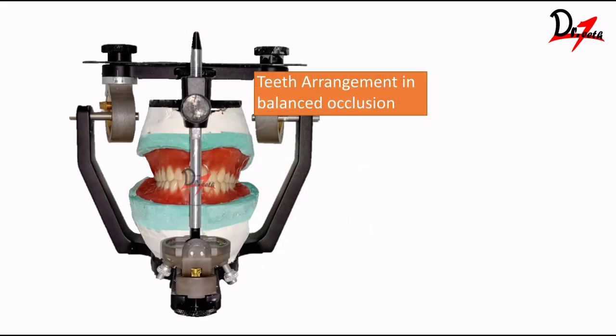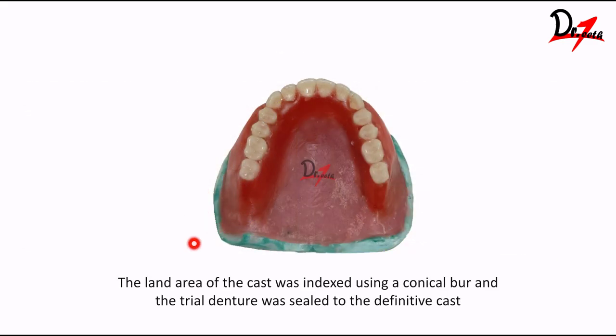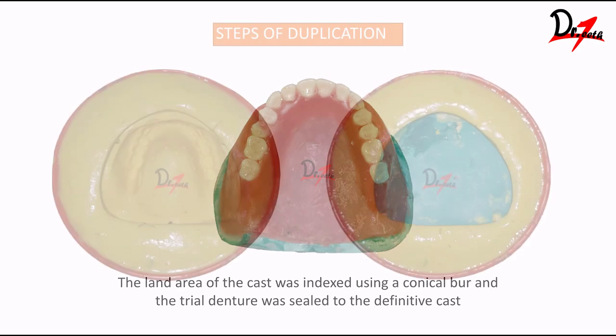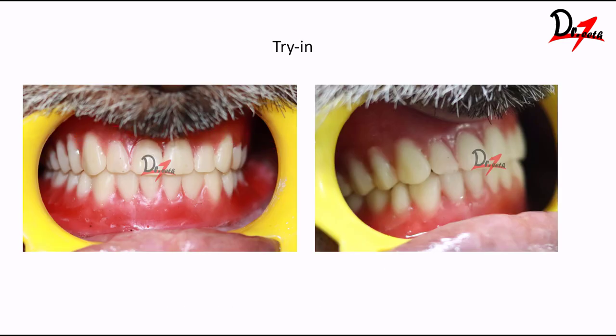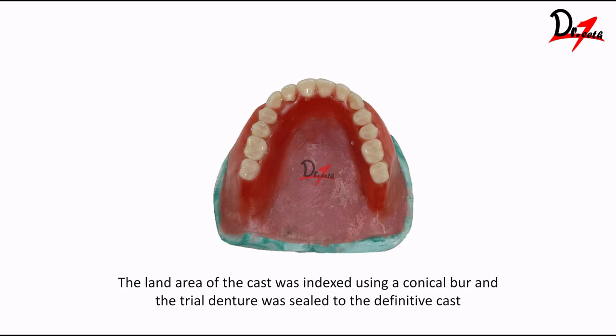Teeth arrangement was done in balanced occlusion. This is the try-in of the patient. From here comes the procedure of making a hollow denture. As you can see, there is extra wax here which is not usually seen. While trying the denture on the patient, I felt the denture was not giving proper support to the cheeks on the buccal side, so a little cheek plumper was needed. That is why I decided to give a little extra thickness of acrylic here. And since we are going to make a hollow denture, the weight is obviously reduced, so we can add that.